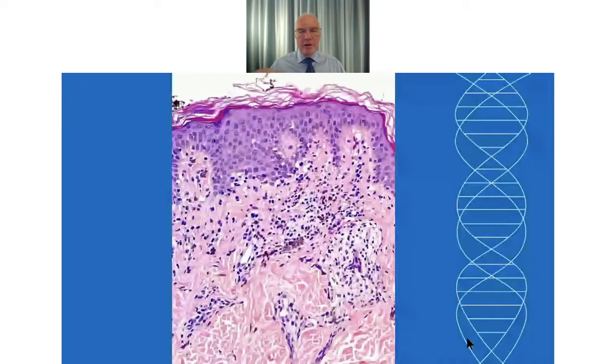This webinar, I'm showing you a slide seminar. I've put together half a dozen cases that I reported in the days shortly before the idea for this webinar came. So I think some of you are pathologists and will know exactly what you're looking at, and some of you aren't. So to begin with, I'm just going to say a few words about the skin.